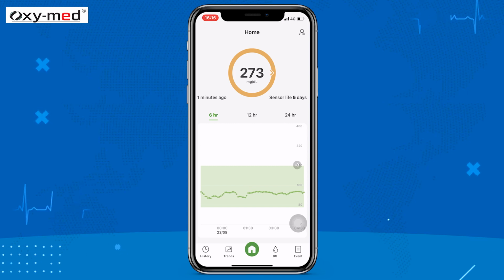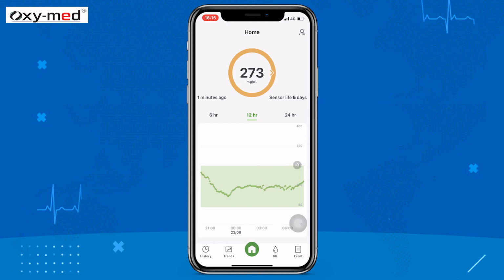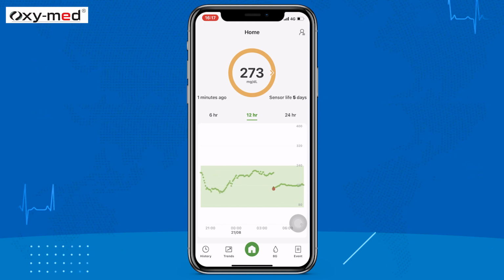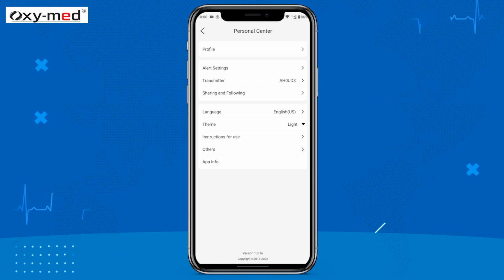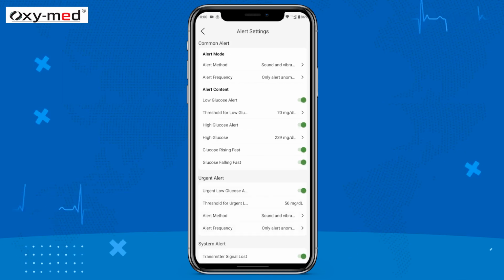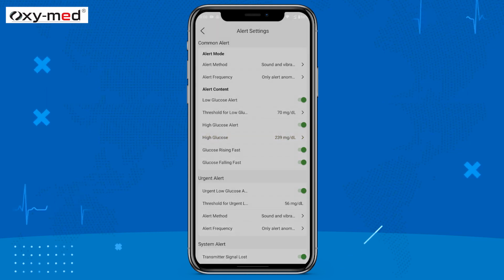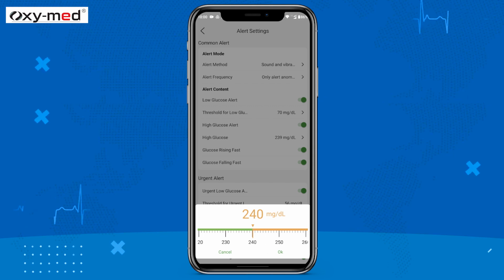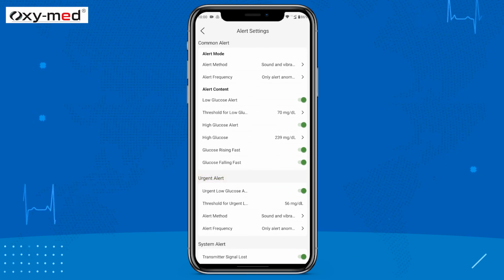Your app receives the sensor readings every 5 minutes. In the blood glucose graph, if a glucose reading goes below the low glucose alert or above the high glucose alert, the point will become red or yellow respectively, and the system will issue an alert notification. You may set the high and low glucose alert values. Your urgent low glucose alert will appear if the reading is below 56 mg/dL. You cannot change this urgent low glucose alert.